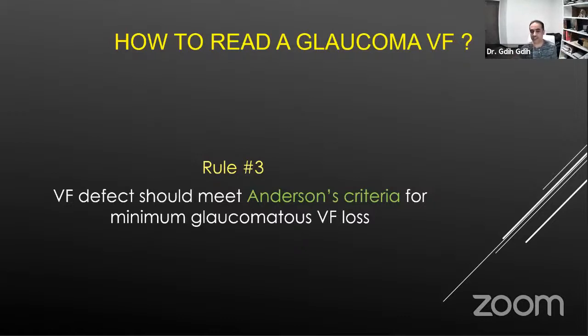So we cannot just learn this and then apply it. We have to apply it properly, because we cannot say, okay, this is a non-glaucomatous visual field, so the patient doesn't have glaucoma, no treatment. But we look at them, they already have an enlarged cup-to-disc ratio, a strong family history, three brothers went blind, and their pressure is 35.